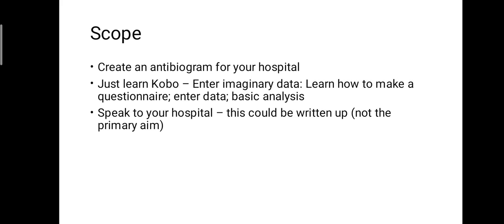The second scope is that you can use this project to just learn Kobo, especially people who are already in CMC. We have our own antibiograms already made, so there won't be a need for you to create another antibiogram because it already exists. And I'm sure the microbiology department keeps updating it then and there. But if you want to learn Kobo, you can also join in.